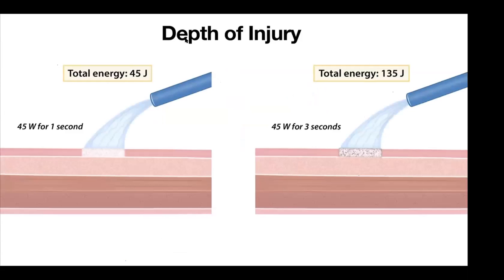All right, so let's look at the data. So here is colon, and they kept it at a stable distance, and they used 45 watts. In this one, they delivered it at 1 point for 1 second. That is about this amount of energy total delivered.